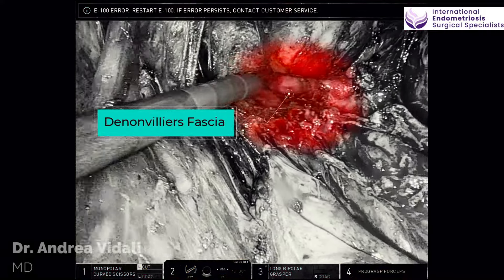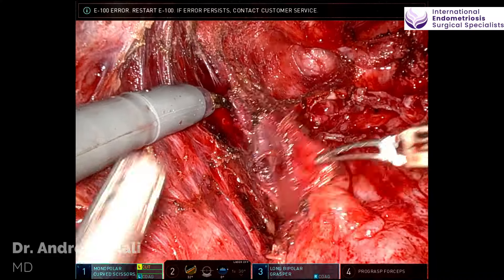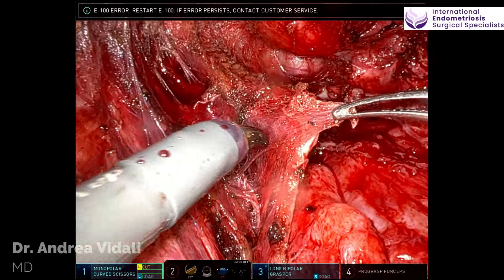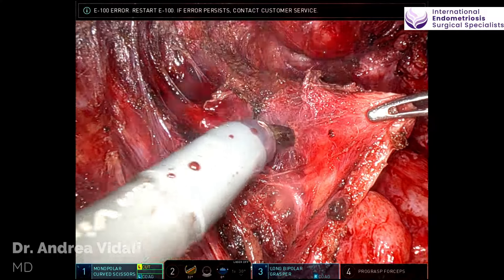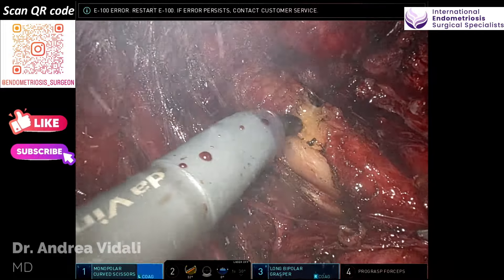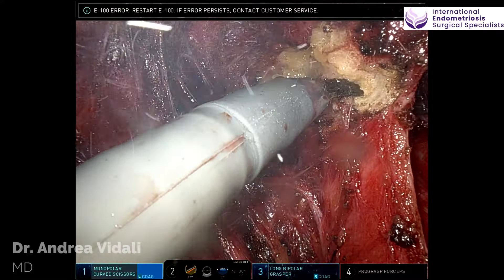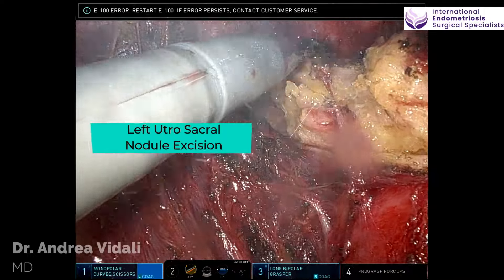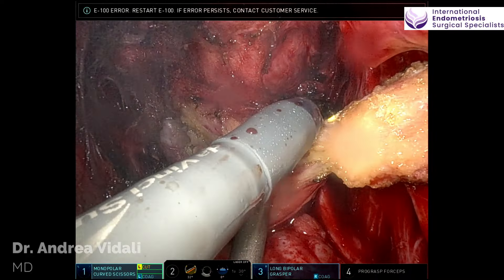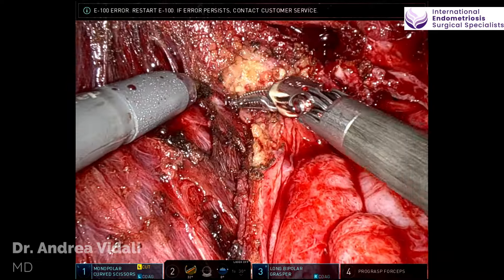What you see there is the actual rectovaginal fascia, and the tip of the VALCHEV that pushes against the vagina. The cervix is going to be a little bit higher. As we dissect out progressively the left perirectal fossa, you can see that a lot of that perirectal fat is actually desmoplastic and therefore abnormal. These changes are due to inflammation — the fat doesn't have the same color and certainly doesn't have the same consistency. It becomes hardened.